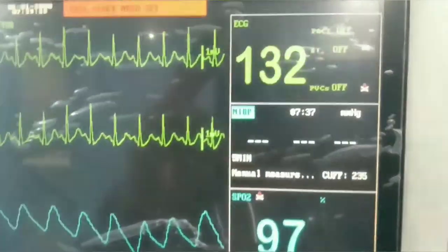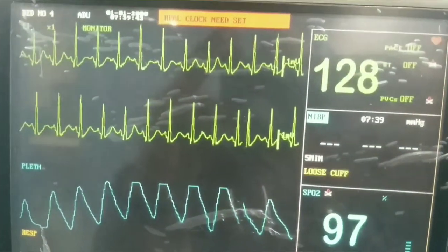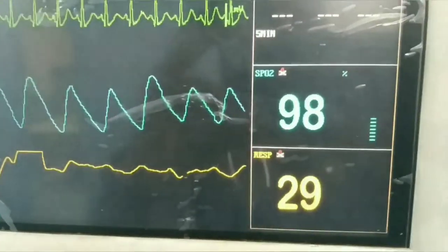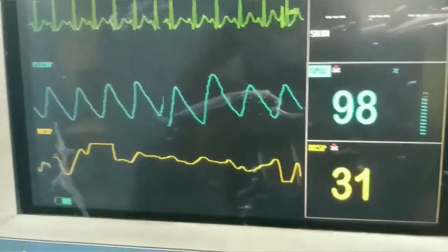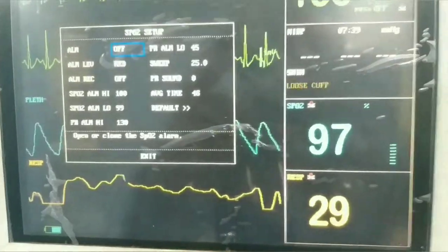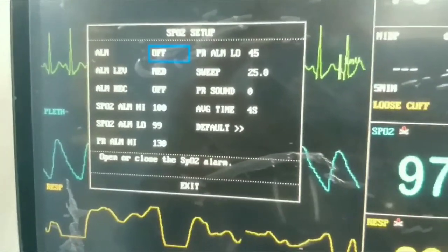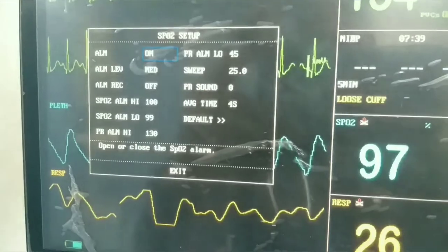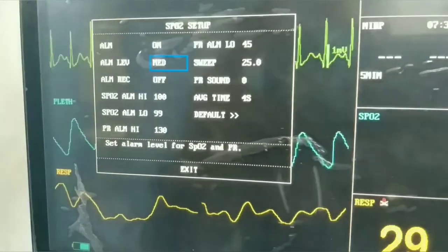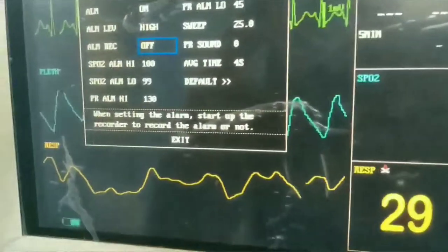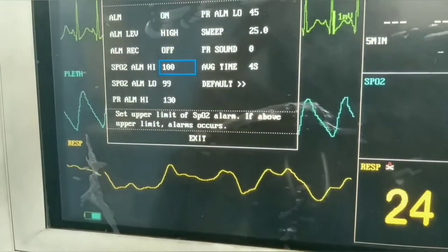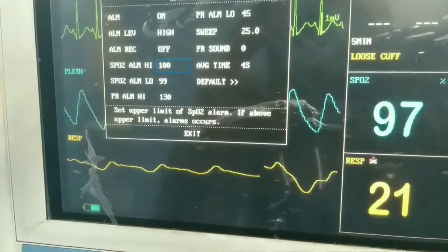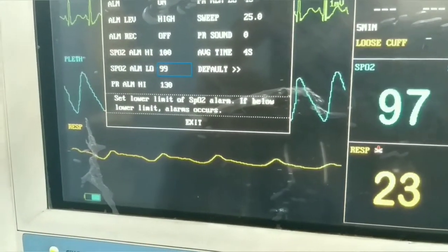The SpO2 is 97% and the heart rate is 128. We can go into the menu setting of SpO2. The menu shows an alarm which we can make on or off using the dial. There are two limits: a higher alarm limit and a lower alarm limit. If either limit is crossed, there will be a beep.